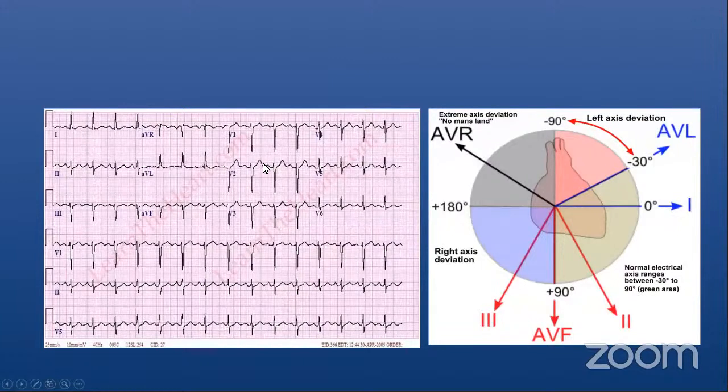So this ECG gives you an example of, look at that axis again. Lead 1 will be in that direction, we know, and then looking at lead AVF, this is negative, so it is going to be in that direction, meaning that is the quadrant. And then look at the highest amplitude, which probably is in either lead 1 or AVL. So it's going to be about -30 axis.